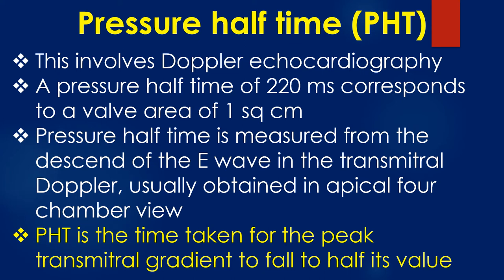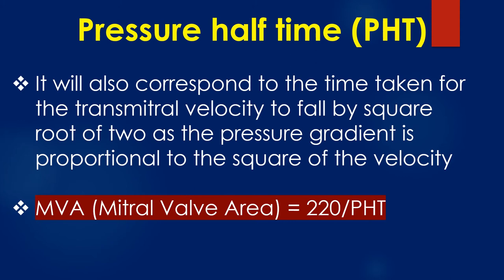Assessment of mitral valve area by pressure half-time involves Doppler echocardiography. A pressure half-time of 220 ms corresponds to a valve area of 1 cm². Pressure half-time is measured from the descent of the E wave in the transmitral Doppler, usually obtained in the apical four-chamber view. It is the time taken for the peak transmitral gradient to fall to half its value, corresponding to the time taken for the transmitral velocity to fall by the square root of 2, since the pressure gradient is proportional to the square of velocity. Mitral valve area equals 220 divided by the pressure half-time.